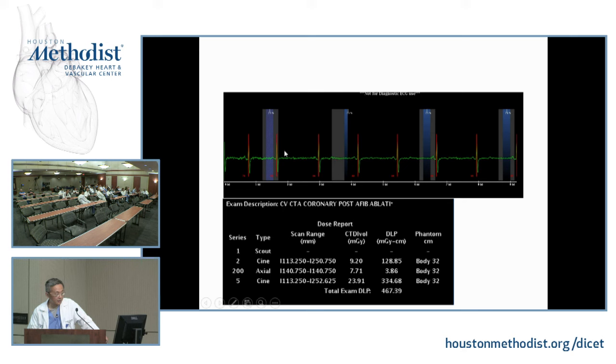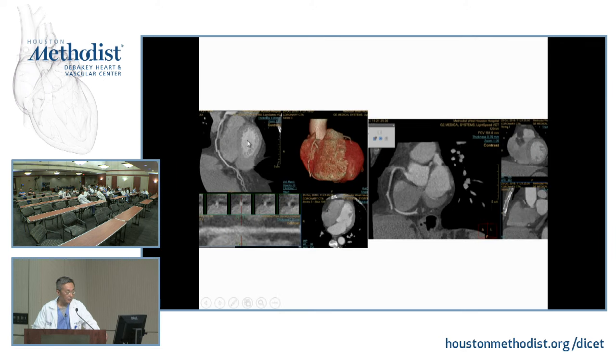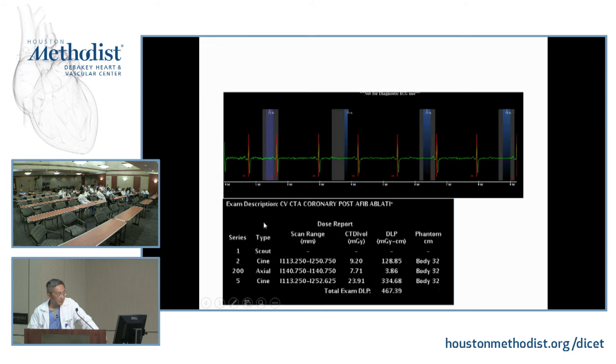See, this is very important. That's another concept: slow doesn't mean everything's fine. It's probably either PAC, or I think the P wave looks like it could be sinus arrhythmia. You can see, this beat is really the one that caused most of the step artifact right there, right? So you can see the blurriness, okay?